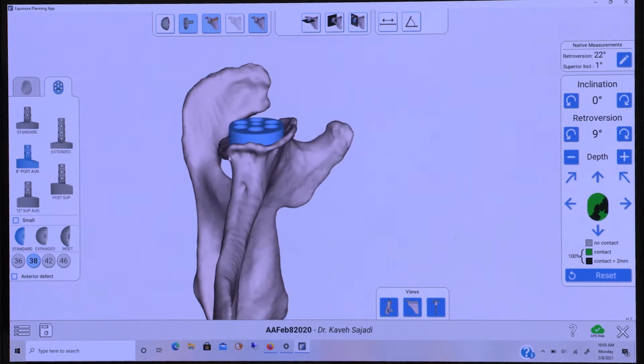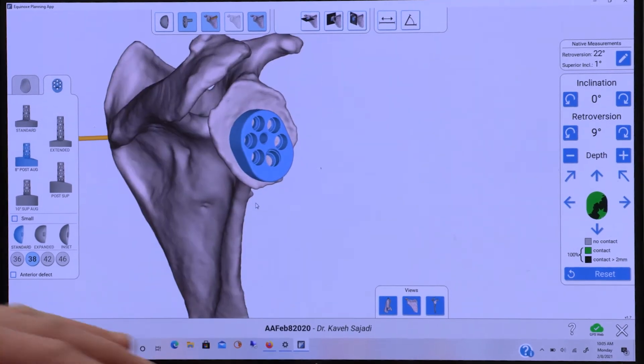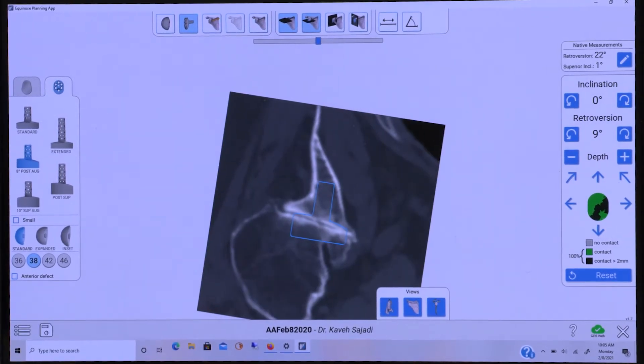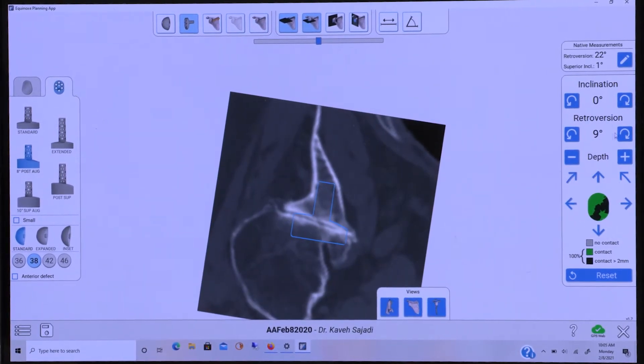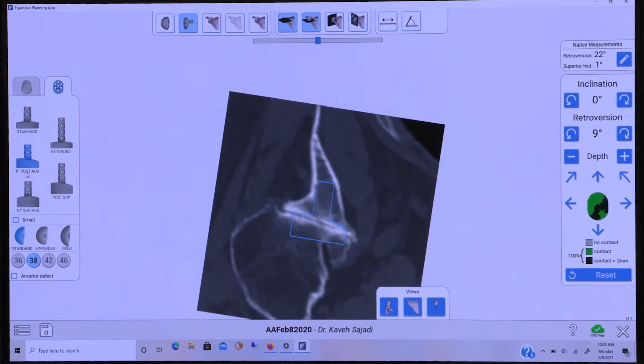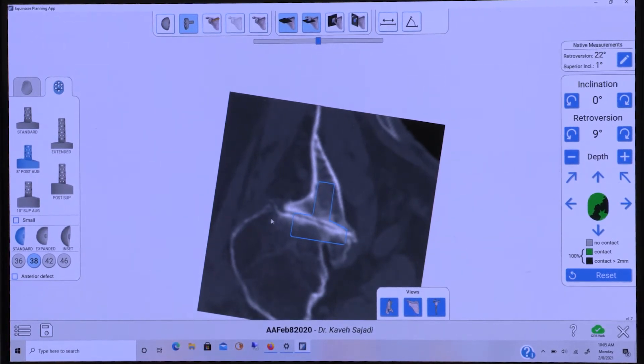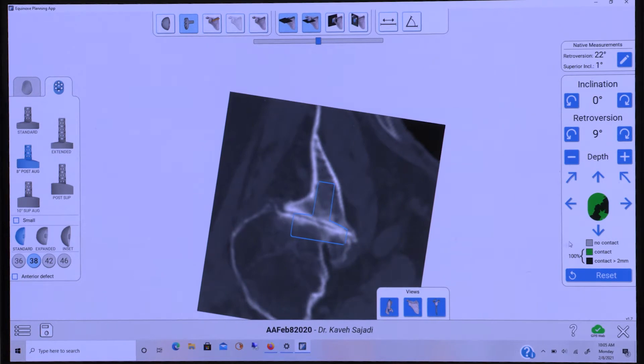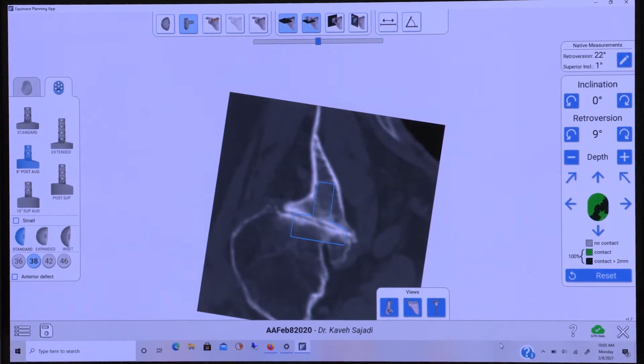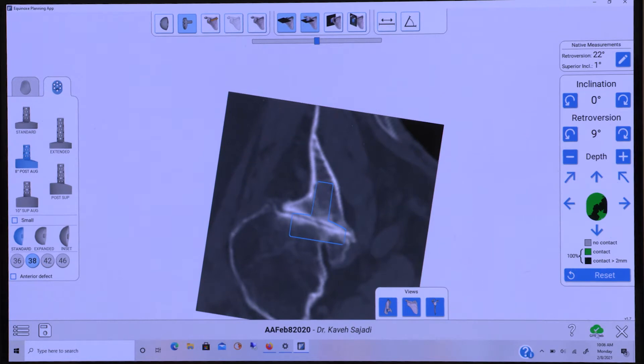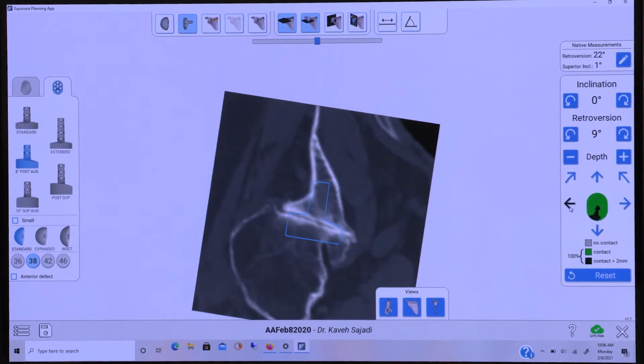She has 22 degrees of retroversion, and I'm using the planning software to determine that I will place an 8-degree posterior augment in approximately 9 degrees of retroversion, obtaining 100% backside contact as noted on the imaging.